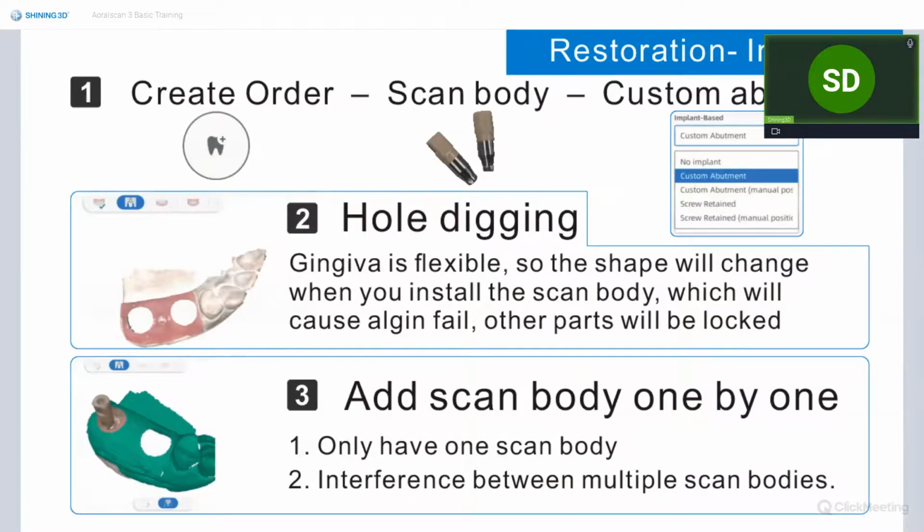So these shadows in different places will cause the color to vary. So that's it.